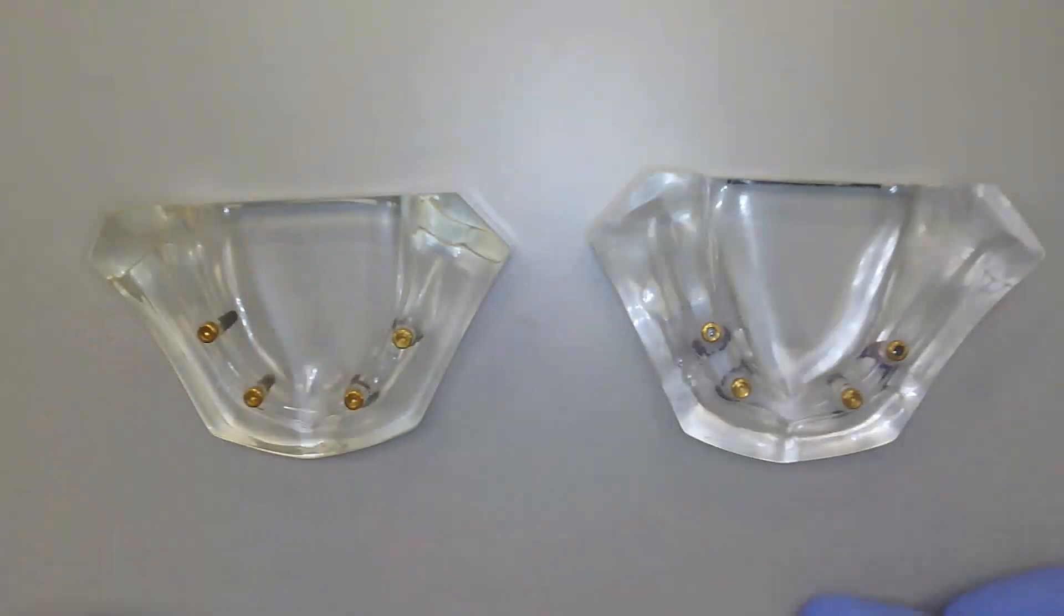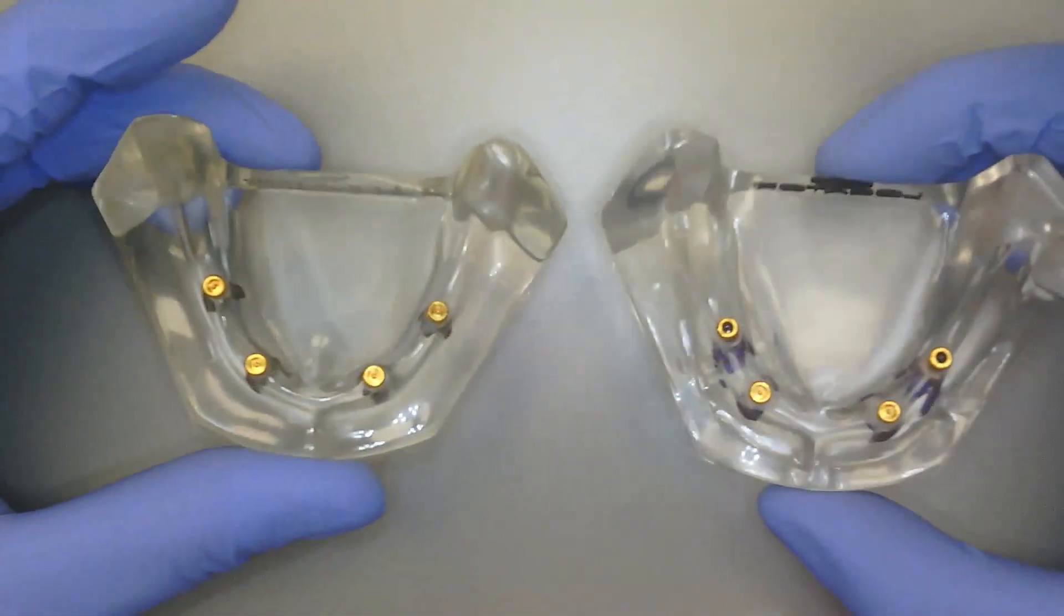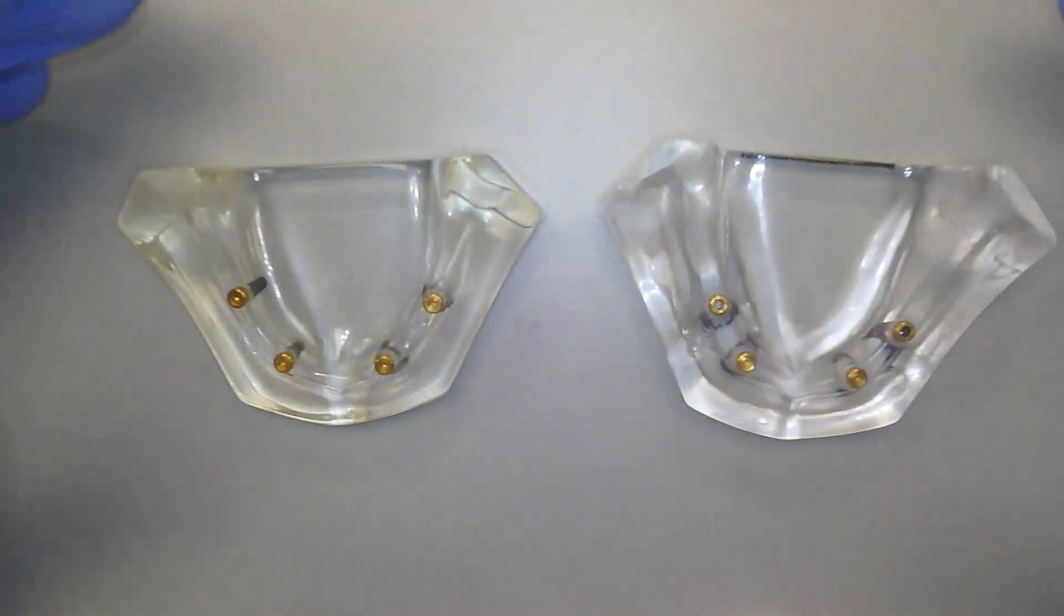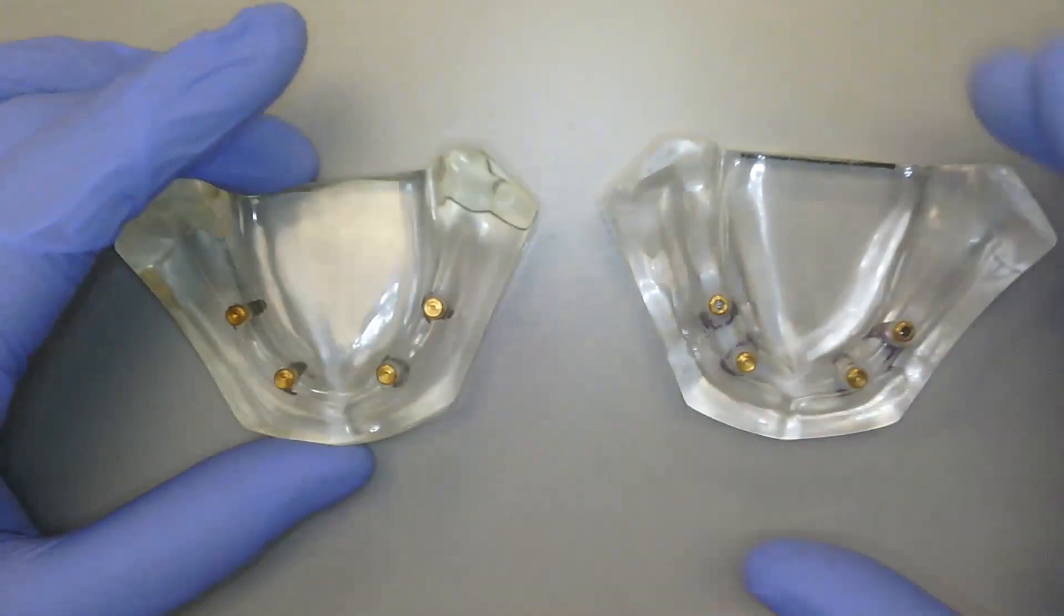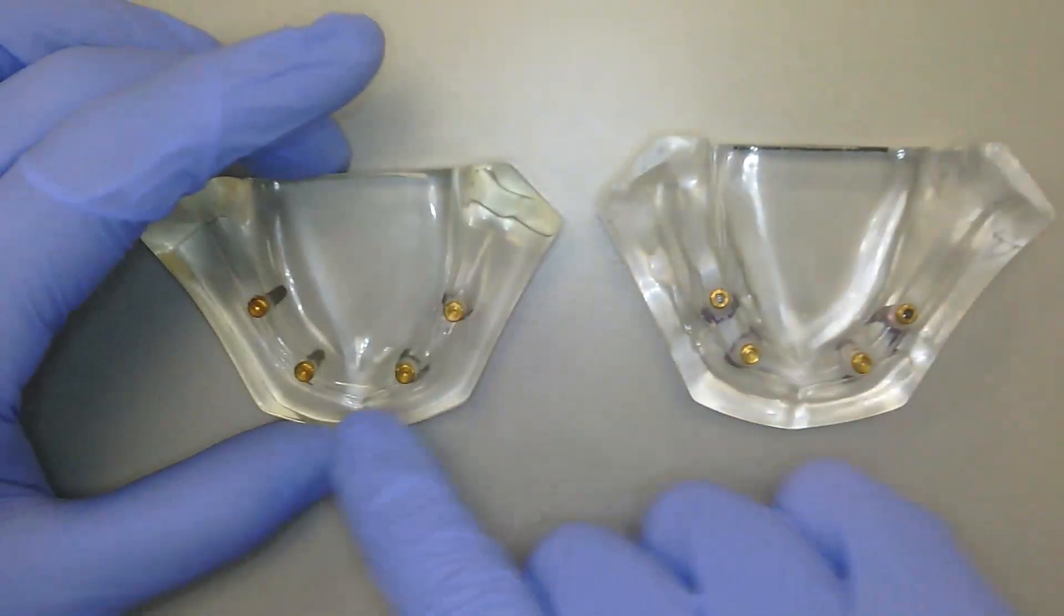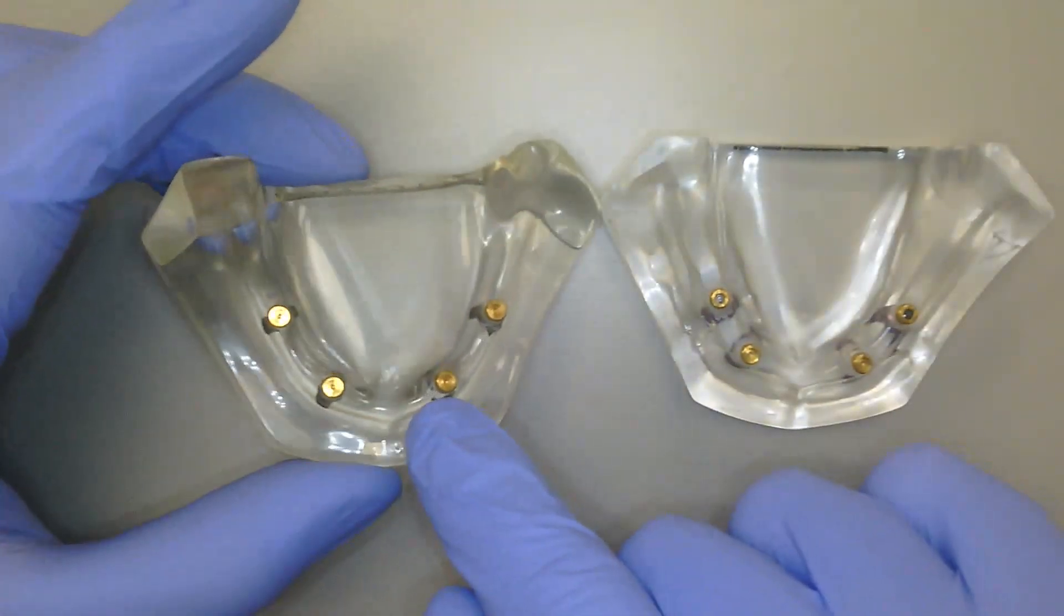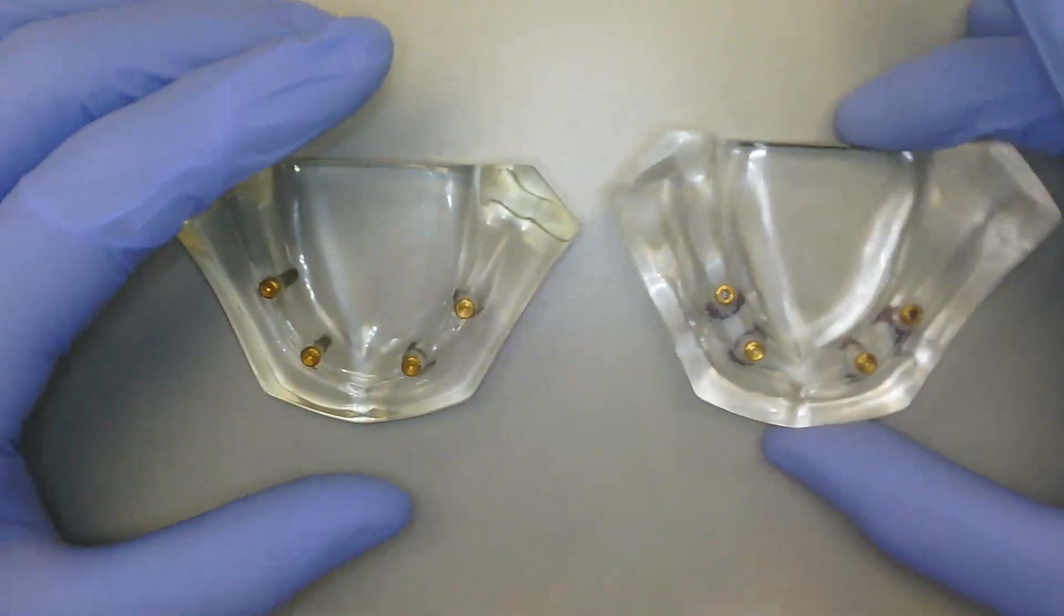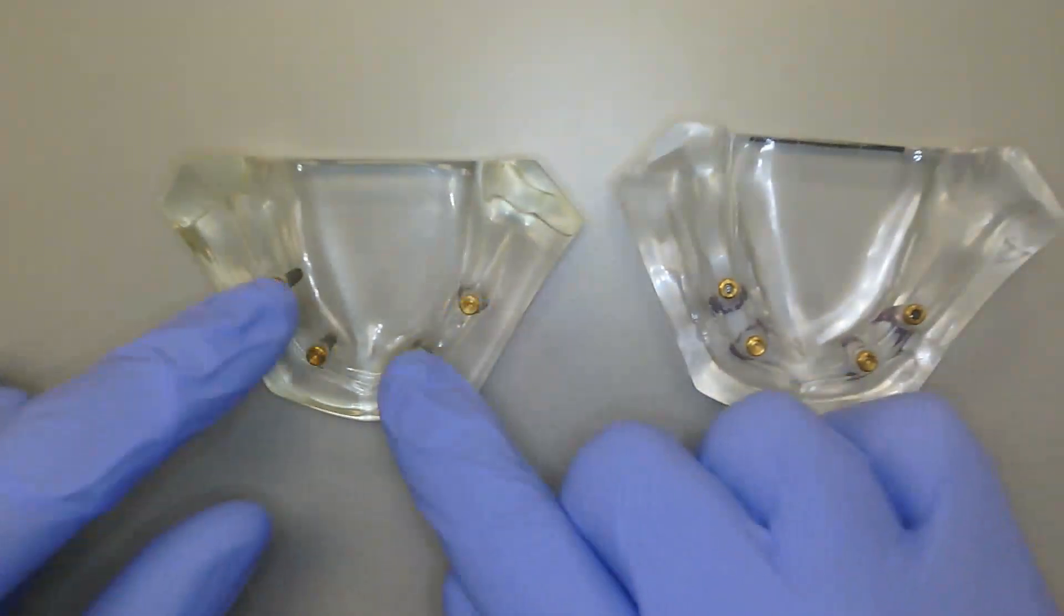Now the first thing that we're going to look at when we take a look at these is they look awfully similar. You can see here across the board, I have that characteristic goldish color of the locator abutment, plus you can see the distinctive triangle of the traditional locator abutment.